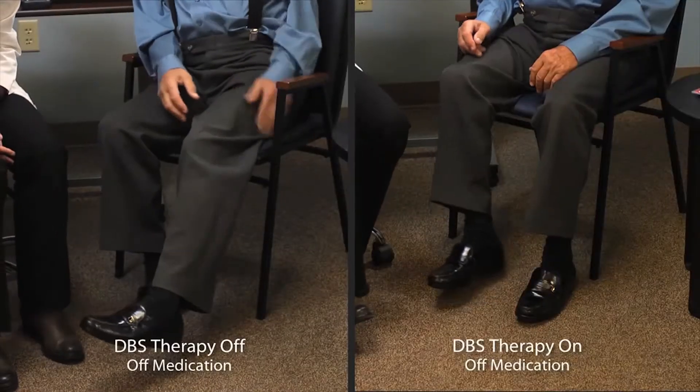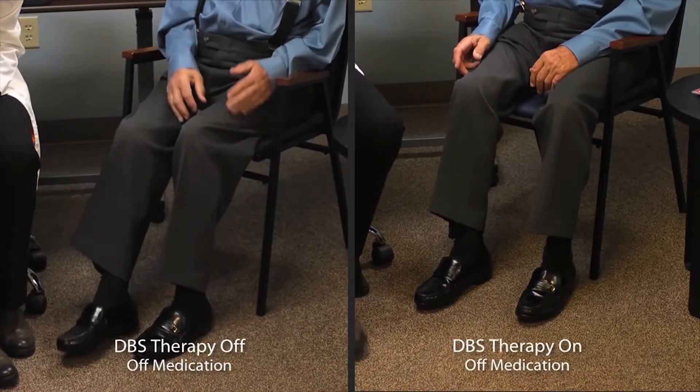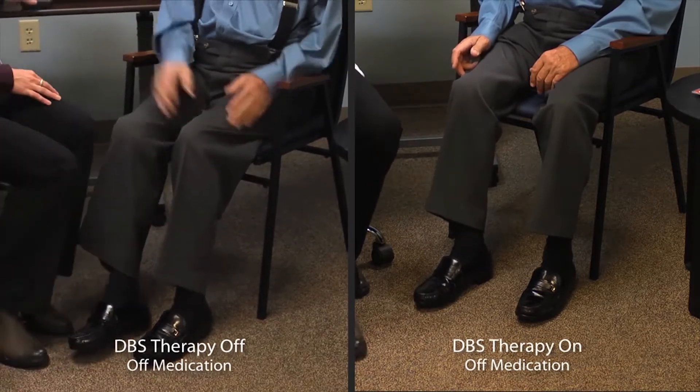Are you able to do the other leg? This is another one. That's okay. That's okay, you're doing good. Okay. Great job.